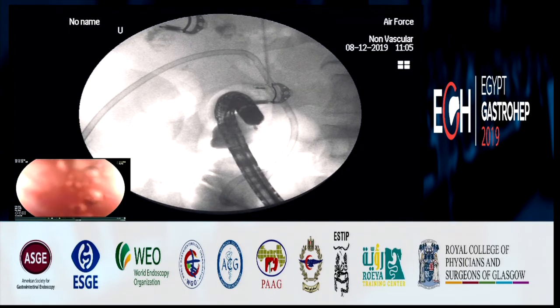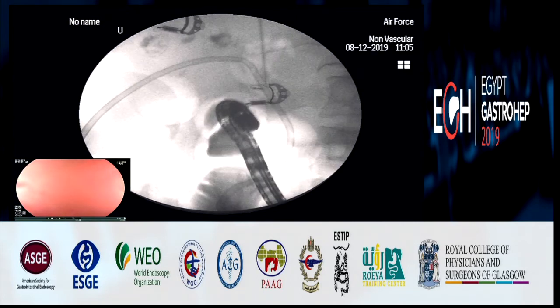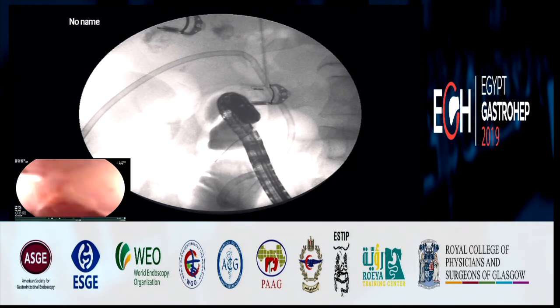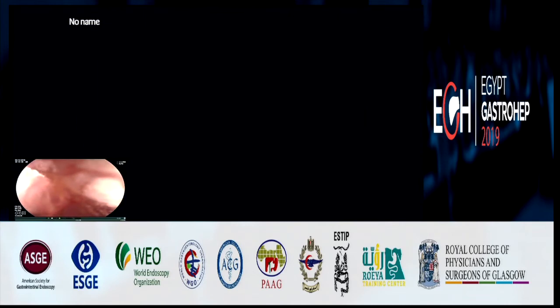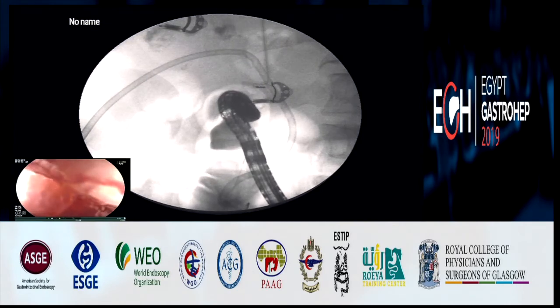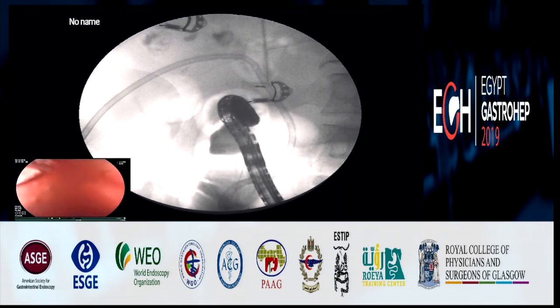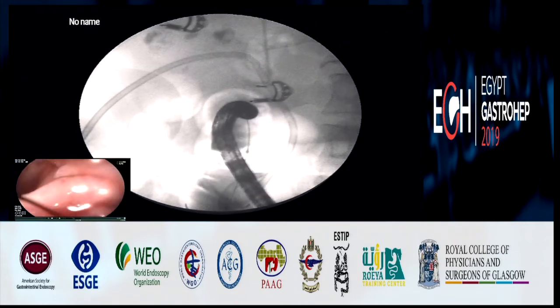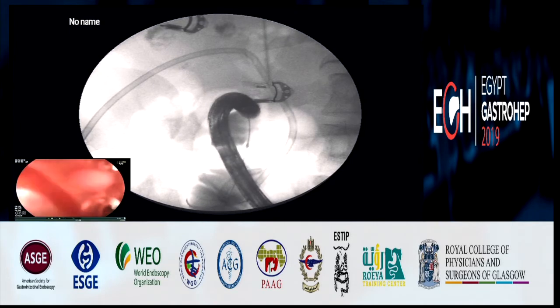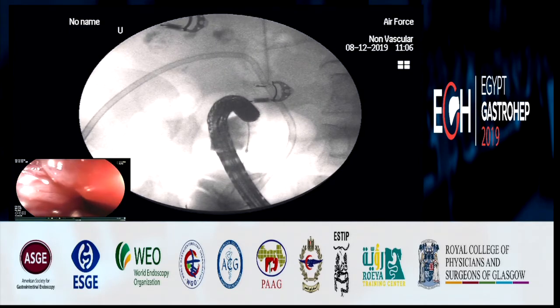In fact, the strategy for this patient is to perform an hepatico gastrostomy in order to drain the bile duct. So here, I will place a short duodenal stent that will be transpyloric, getting through with the wire. Selma already reached with his guide the distal part of the second duodenum. So now I'm going back a little bit, and we will make the exchange, and I will take the 9 centimeter duodenal stent from Cook, the Evolution. So I'm going back with my catheter.